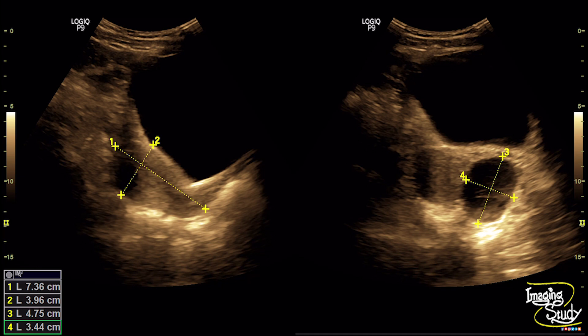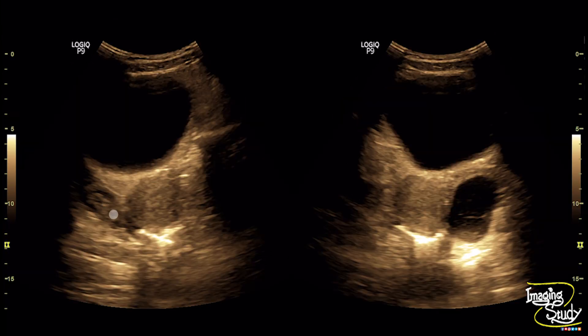We rechecked this patient after 6 weeks and fortunately found nothing on the left adnexa except a normal ovary, which suggests very good resorption of the lesion. Here is the picture of the right ovary on the right image and the left adnexal hemorrhagic cyst on the left one.